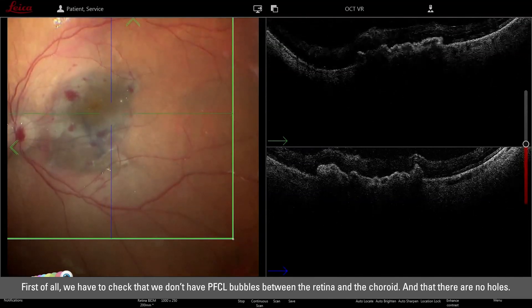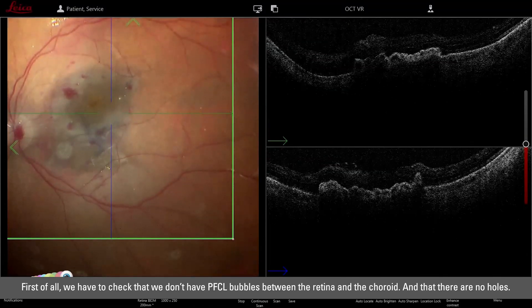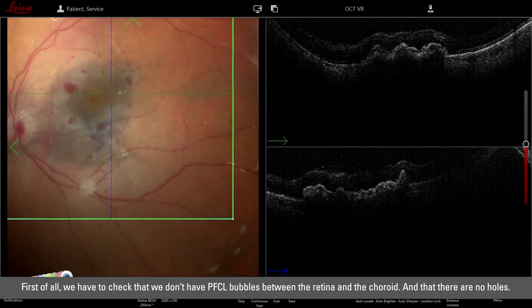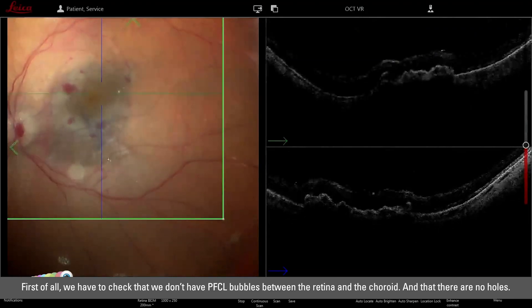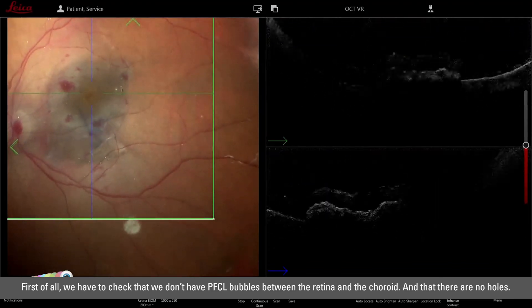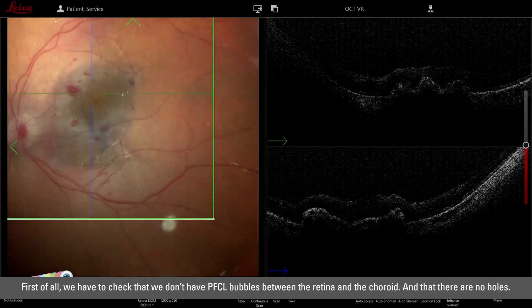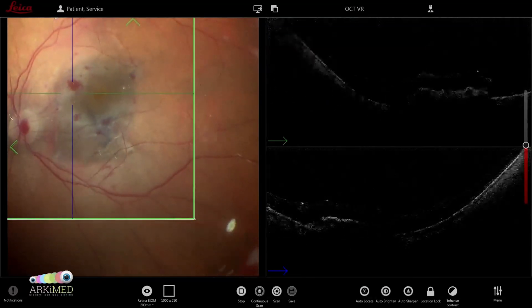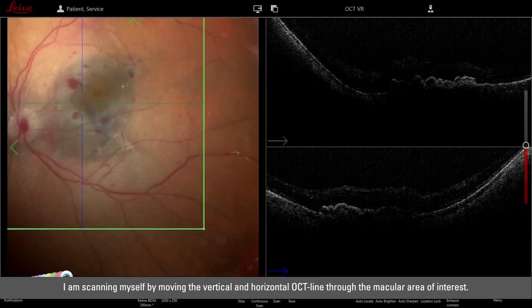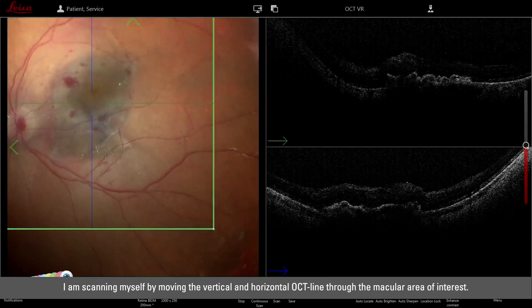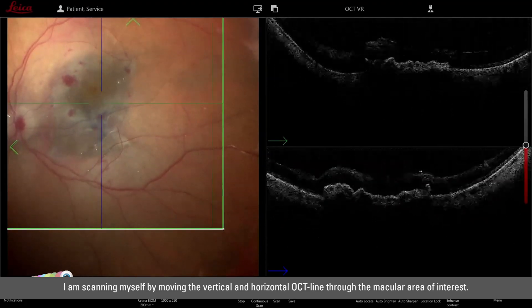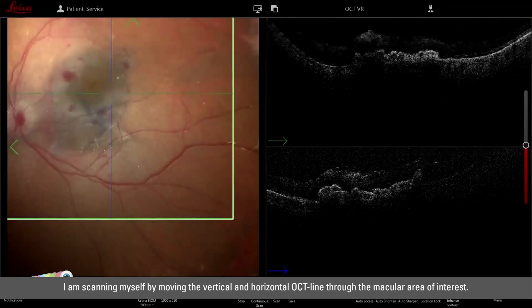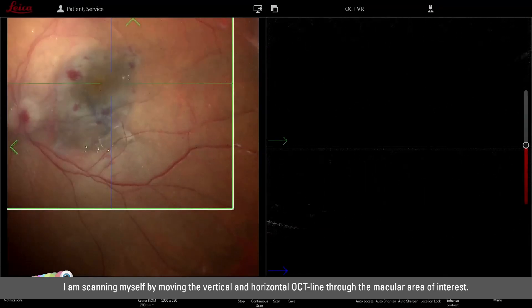Let's focus on the intraoperative OCT right now. I want to check that there are no PFCL bubbles underneath the retina and that there are no holes that I have to treat. I am scanning myself, moving the vertical and horizontal OCT line through the macular area of interest.